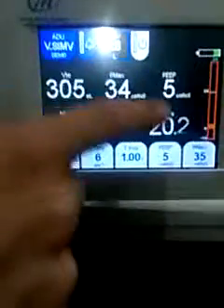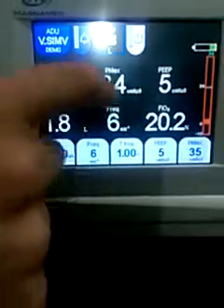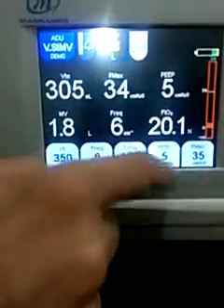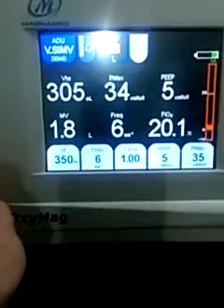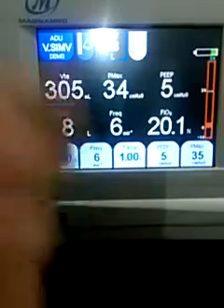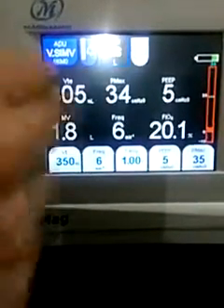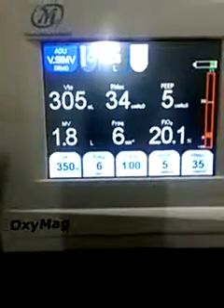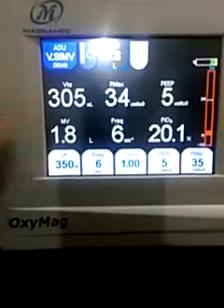Of course, all these parameters are just to show you whether the parameters you are providing to your patient are correct or not. For example, we are delivering to the patient right now 350 milliliters. The patient is receiving around 300, plus or minus. So we always have a tolerance of 10% plus or minus on everything.